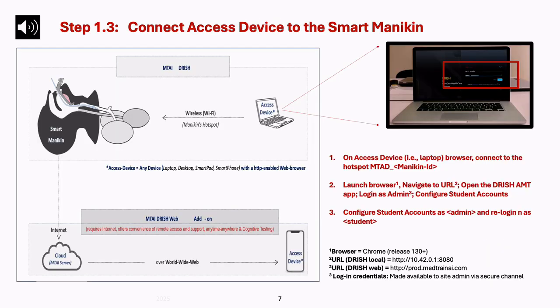Part 1, Step 1.3. Here we connect the access device, like a laptop, to the smart mannequin. There is a browser running on the laptop, and we follow the instructions below to connect it to the smart mannequin.